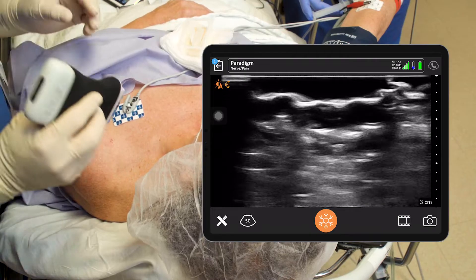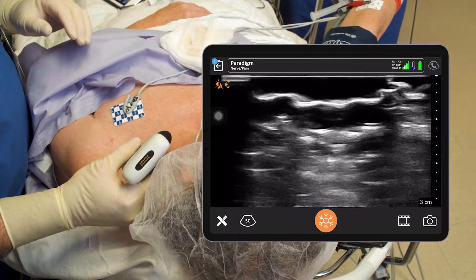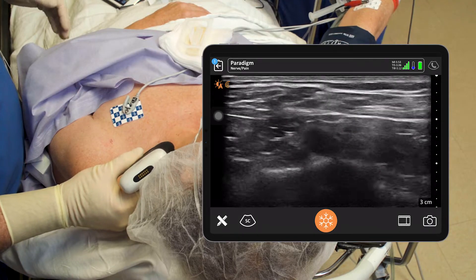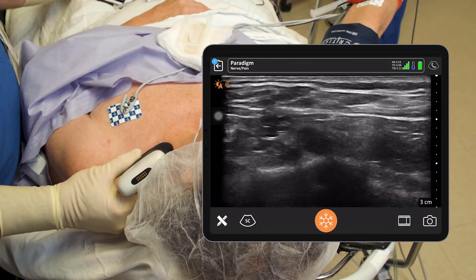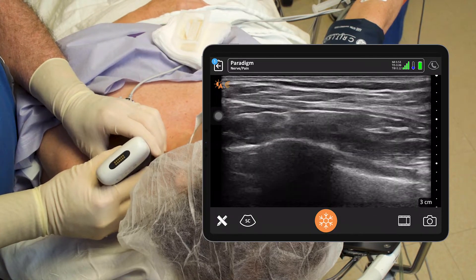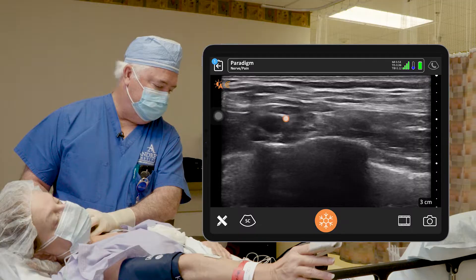We're going to start with the probe just above the clavicle, kind of parallel to the clavicle and aiming straight down towards the toes. I've got her in a little bit of a head-up position here. You can see the subclavian artery beating.